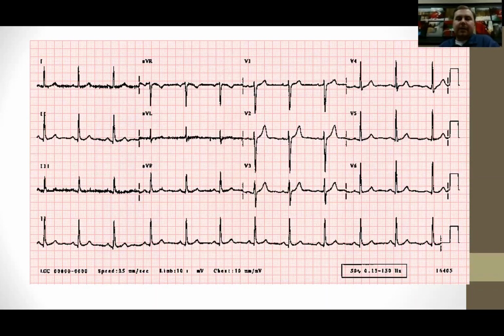So this is my favorite thing to do whenever it comes to teaching people 12 leads in an in-classroom setting. I would give everybody a blank 12 lead with just the leads on it, with no actual electrocardiogram to be seen, and then I would ask everybody to draw a normal 12 lead, because most people don't have an idea of what it should look like on baseline, and that really hinders them from discovering what's abnormal whenever they're faced with a 12 lead that maybe isn't something they've seen very often.